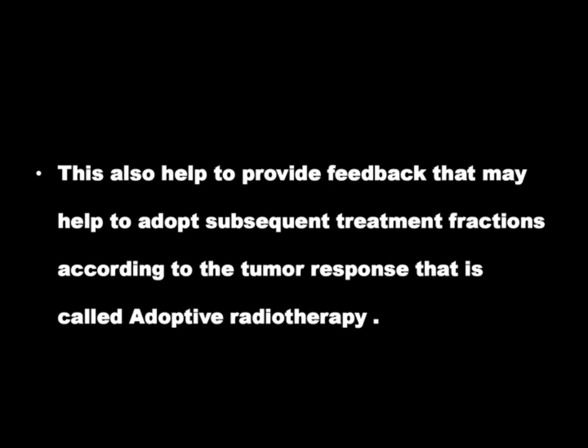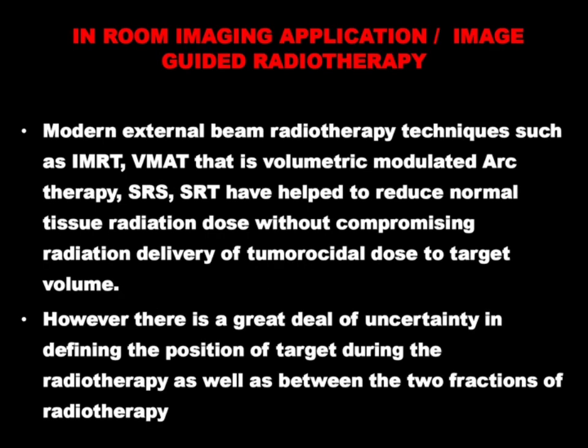Also, we have gone up to the extent of fusion techniques like CT scan and MRI fusion, CT scan and PET fusion, to accurately delineate the tumor. You must have heard of CT PET imaging, and CT MRI imaging fusion. But have you heard about MRI PET fusion? Certainly not.